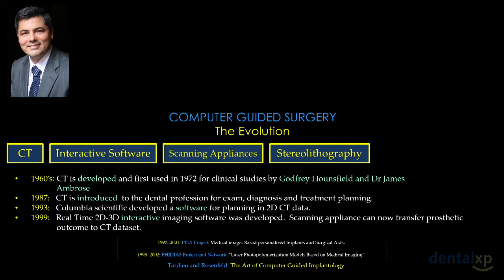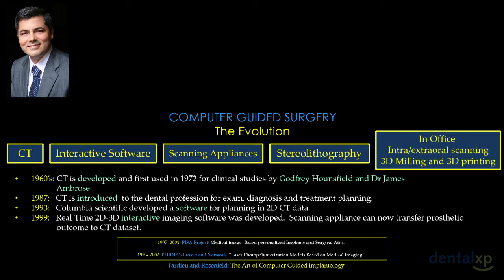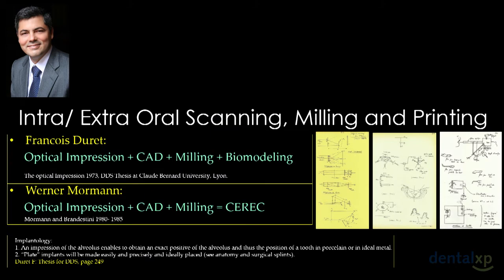And we all have been part of the big explosion in computer-guided surgery, the development of CT, the development of interactive software, the scanning appliances, and stereolithography. It has been part of our career, but what is going on now is a different explosion. It's the explosion of the in-office intra and extra-oral scanning, the 3D milling, and the 3D printing. And it's interesting because these two technologies have been developed hand in hand.